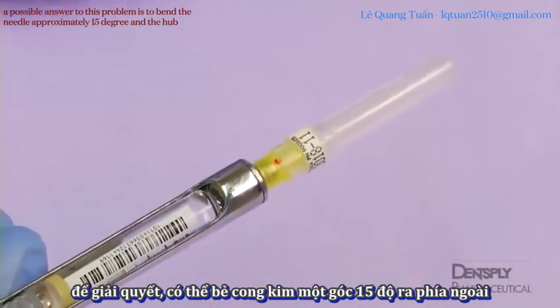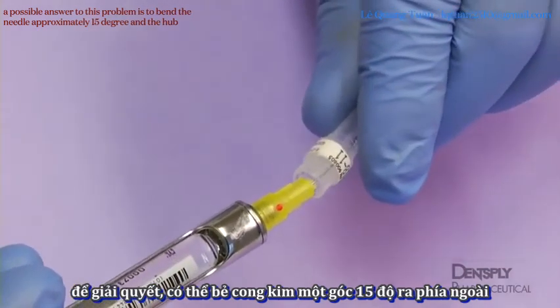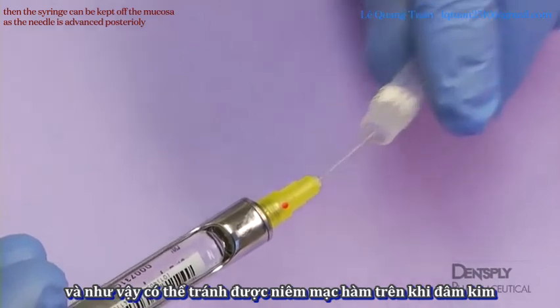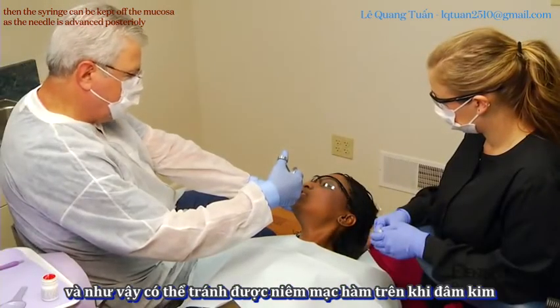A possible answer to this problem is to bend the needle approximately 15 degrees at the hub. Then the syringe can be kept off the mucosa as the needle is advanced posteriorly. Mental nerve block.